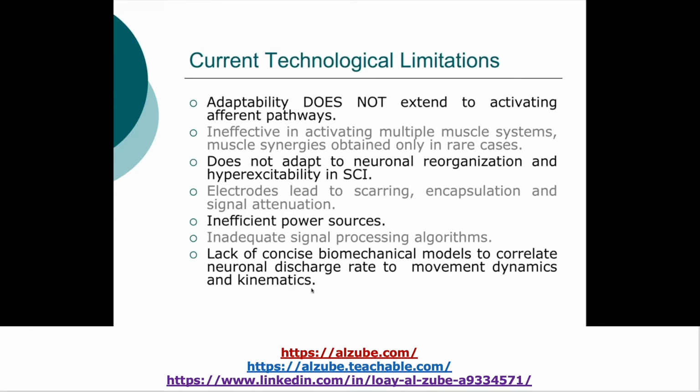So all of these are current technology limitations. We talked about 4 models or modalities of functional electrical stimulation. All of this presents promising challenges for us to engage in and learn more if you are interested in this field.